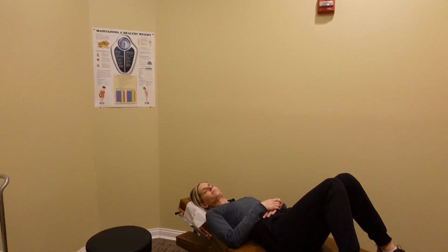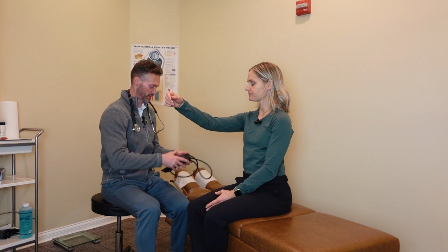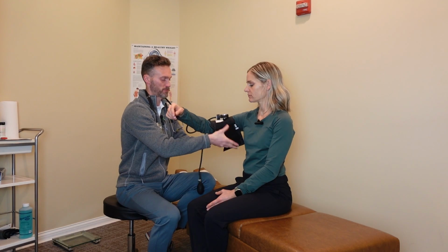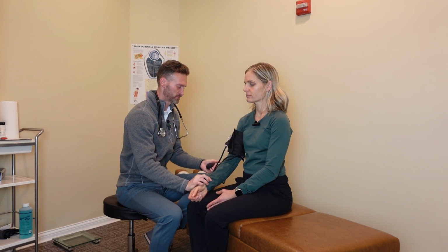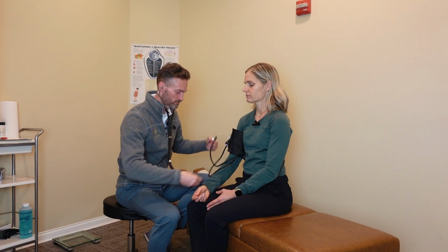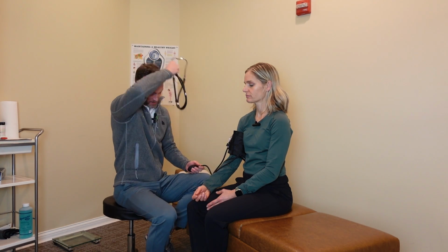All right, I'll have you sit back up, again, face this way, and we'll do your blood pressure again. All right, so again, I'm just going to have you hold your arm straight out like this. Good. And relax. All right, much better.